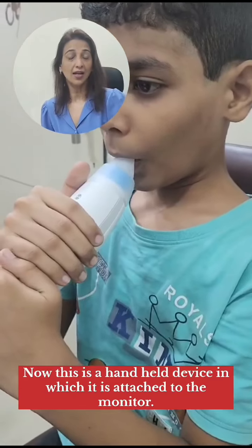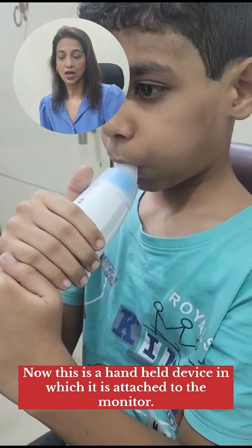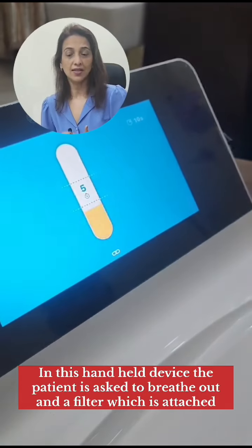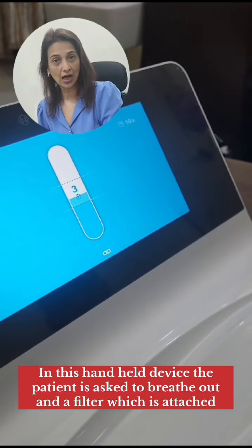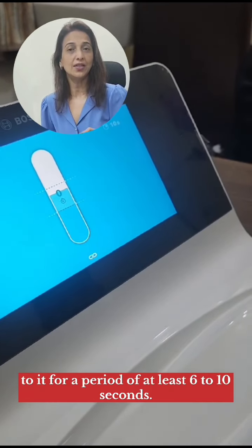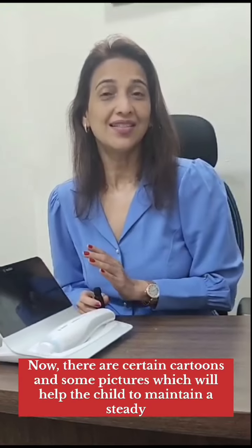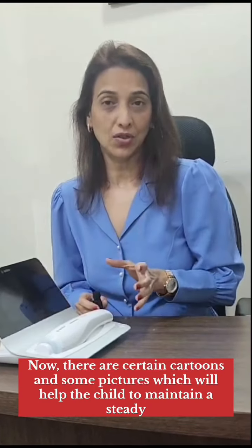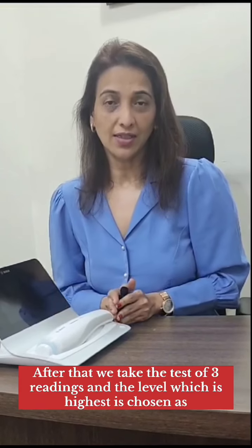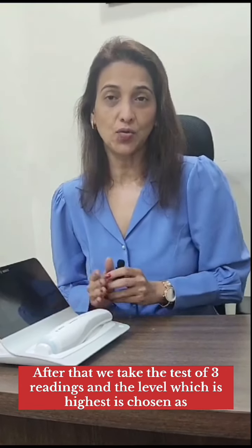Now this is a handheld device which is attached to the monitor. In this handheld device, the patient is asked to breathe out into a filter which is attached to it for a period of at least 6 to 10 seconds. There are certain cartoons and pictures which will help the child to maintain a steady breath for 6 to 10 seconds. After that, we take the best of 3 readings and the highest level is chosen as the level of FENO.